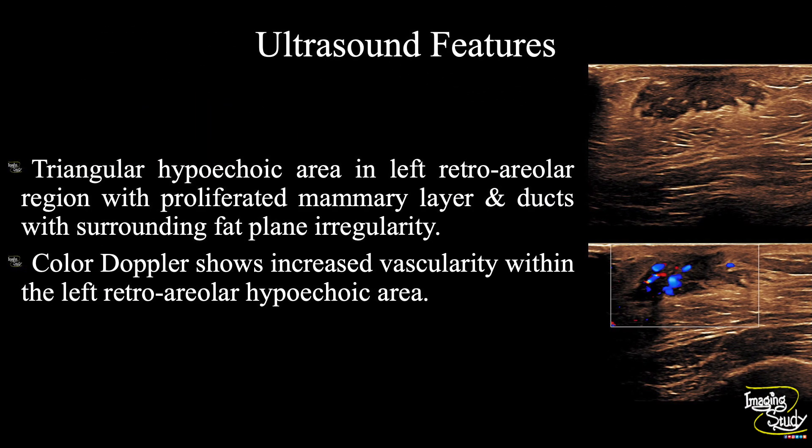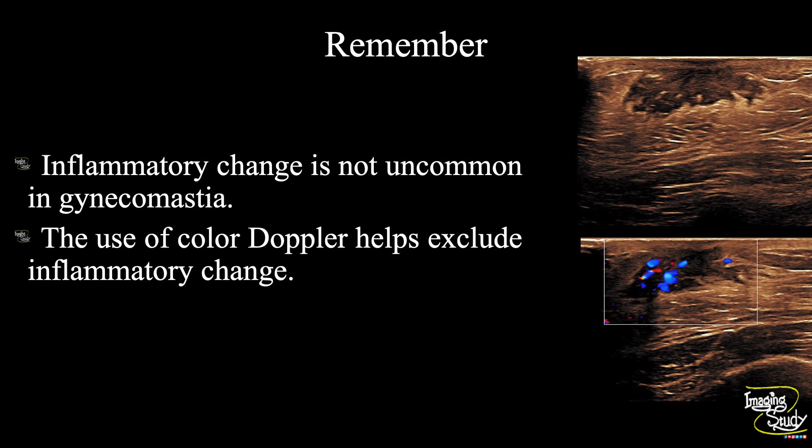In summary, a triangular hypoechoic area is noted in the left retroareolar region with proliferation of the mammary layer and ducts, and surrounding fat plane irregularity. Color Doppler shows increased vascularity within the left retroareolar hypoechoic area. These features conclude this as a case of gynecomastia with mastitis. The take-home message is that inflammatory change is not uncommon in gynecomastia, and the use of color Doppler may help identify this inflammatory change.